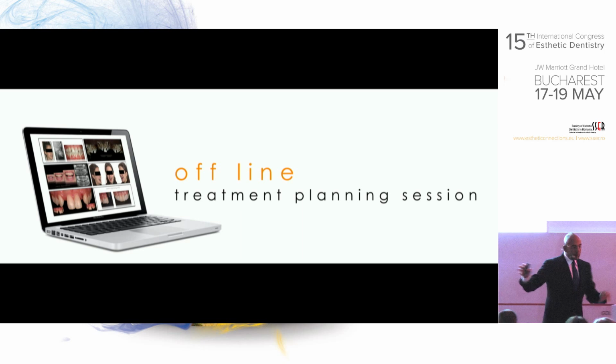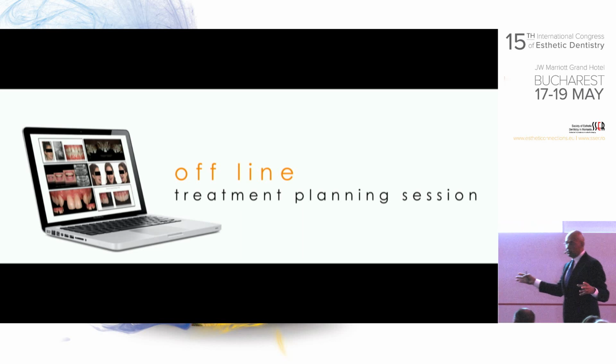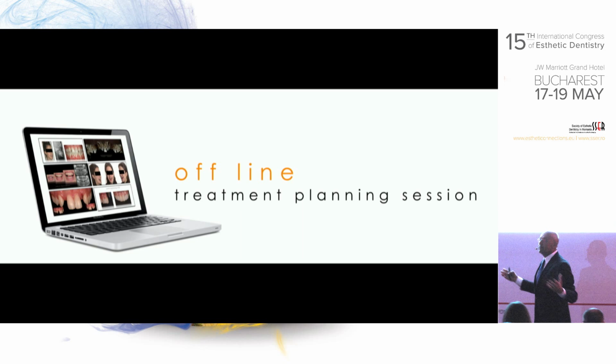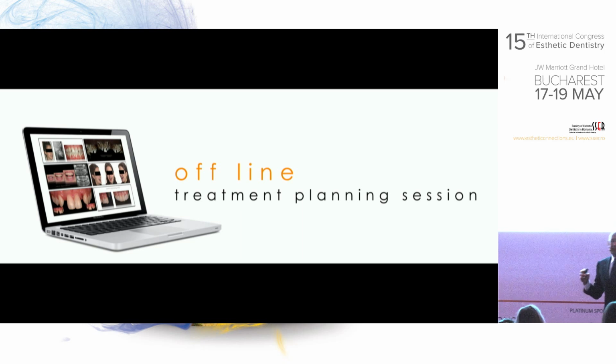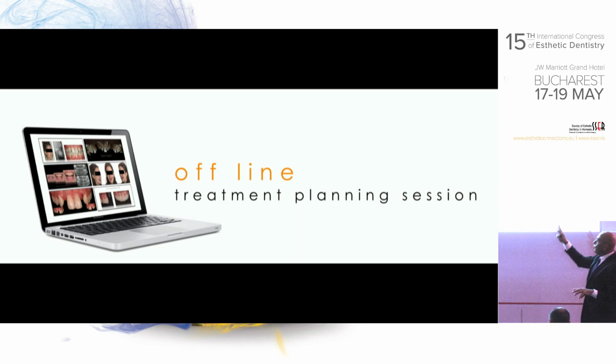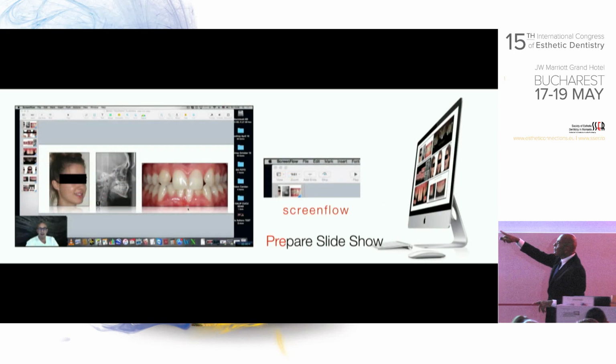So this is simply what we do. I know that I can work with Christian, Adriano there in Brazil, different time zone. I know that my orthodontist can be in another place. Eric, in this case, who did the implant, is in Belgium. So instead of just trying to call them and say, wait, what do you do? What do I do? I first make an offline treatment planning session, which means this is the planning session in which we design the case, or I put my questions into there and just fill this up.